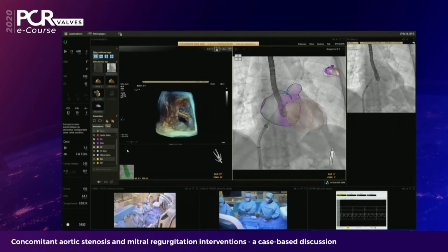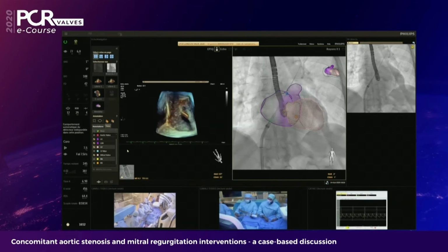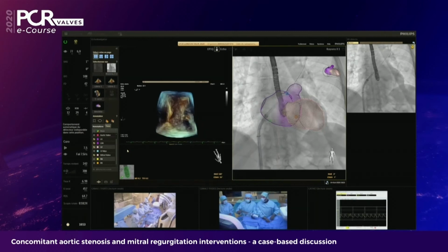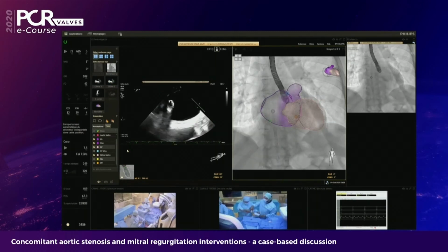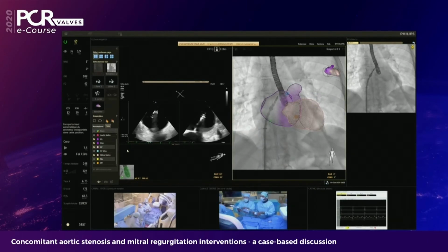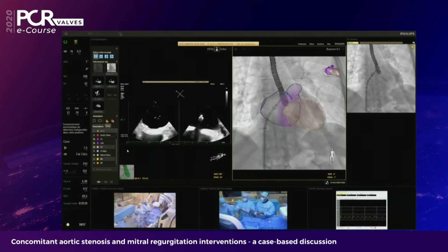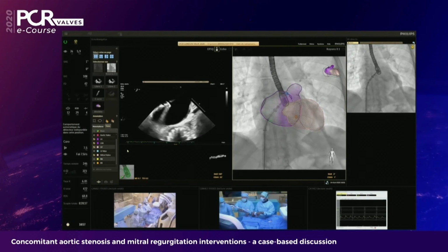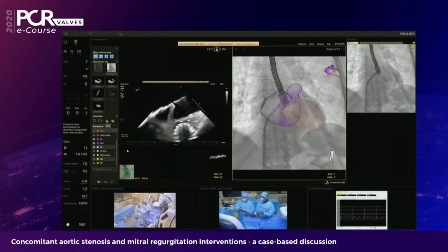Okay, so we are now going to advance the guiding catheter through the transseptal puncture that we just realized. I just have to be careful. You see, we follow the dot, the marker that has been done thanks to the fusion between the echo and the fluoroscopy. So you can see that the fusion here is going to help us identify the marker, not to miss, to keep tracking throughout the procedure. So Lionel is manipulating the clip, and I'll be manipulating the guiding catheter. So I'm giving a bit more anterior, you see. Again, the 3 dots are orienting us.